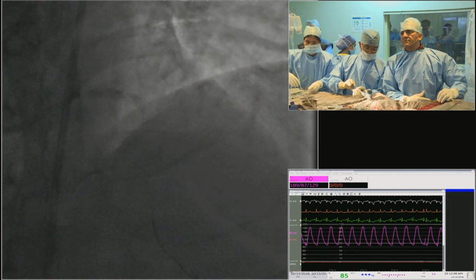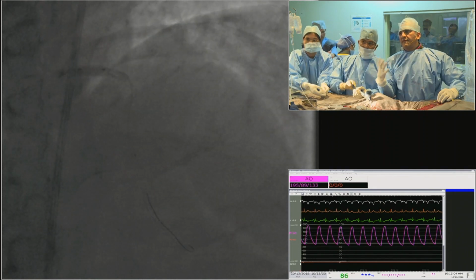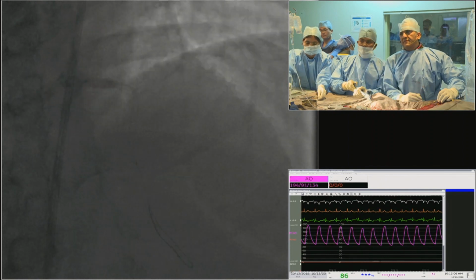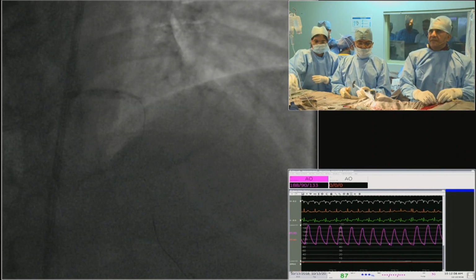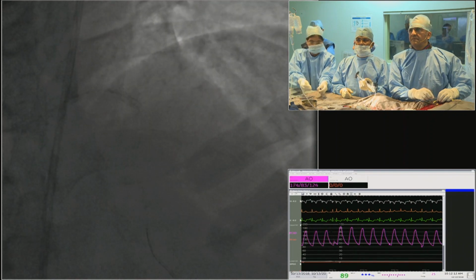We must remember that these are unopposed struts in the left main. The biggest reason for stent distortion is these under-deployed stents, and never do anything more than complete the job in the left main prior to doing anything else distally.